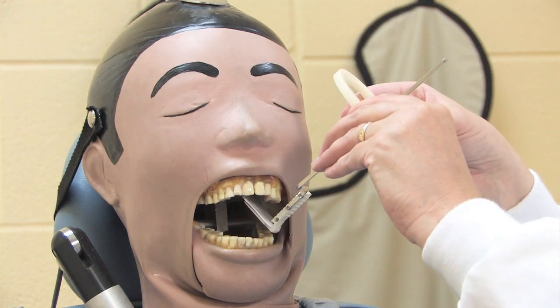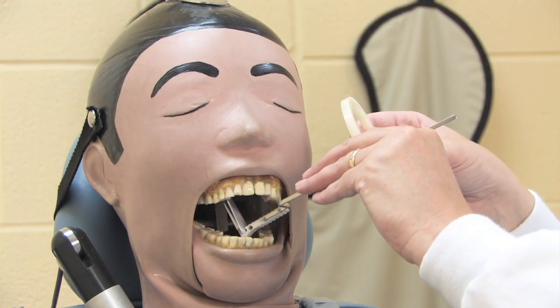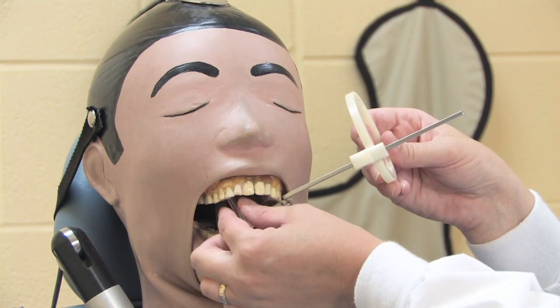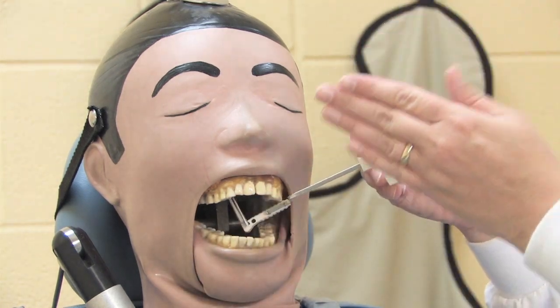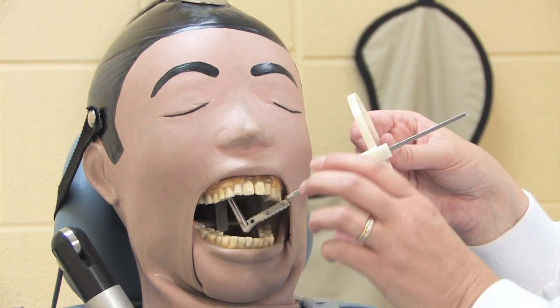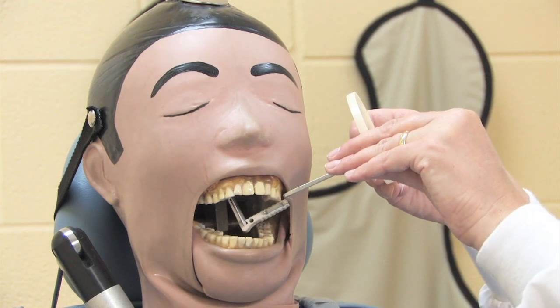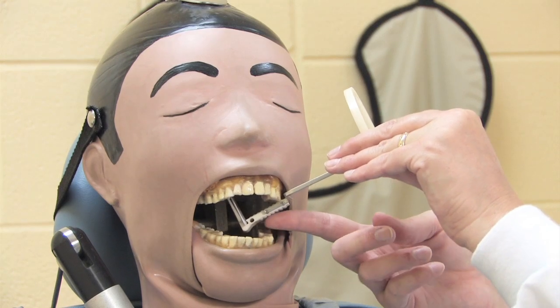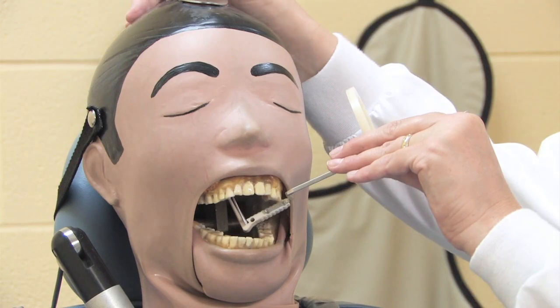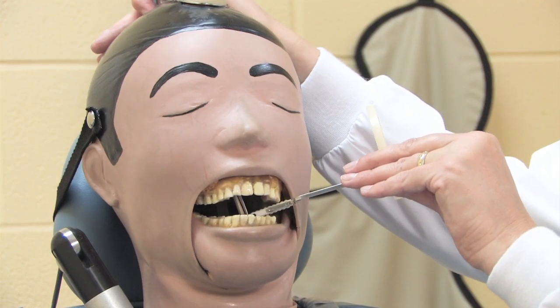For the upper left or second quadrant, the film is placed with distance between the teeth and film, making sure that the film is on the lingual and capturing the distal half of the cuspid or canine. The block is up against the teeth that we're imaging, and the client closes.